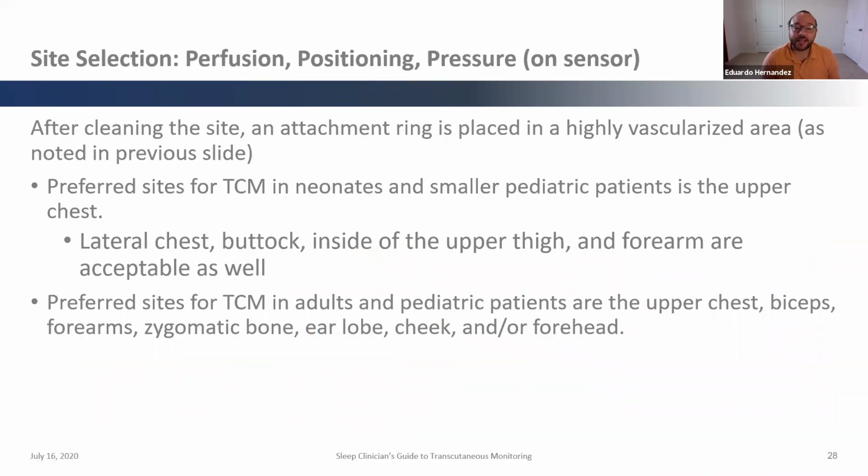But with that said, there's a couple things that you can keep in mind. You also have to keep in mind that the patient, if they're known to sleep on their stomach or on their back or on their side, you always have to keep those things in mind when you choose that site. So it's not that you just slap it on and go with it. There's certain areas that will have better perfusion and certain areas that might be more strategic based off of the patient that you have. But that's the way I like to do it.